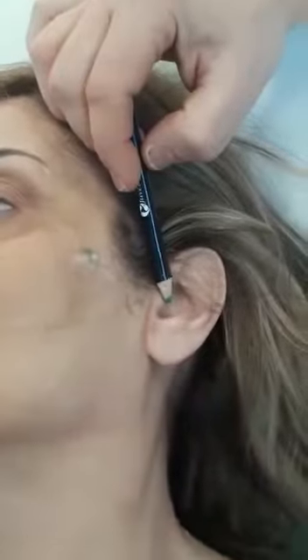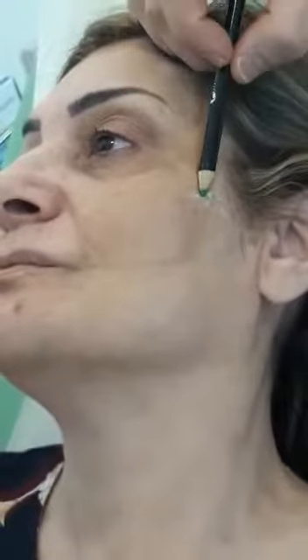Why? Because at this point we have the fascia, the parotid fascia. So the skin is mobile, but the underlying tissue is very firm. And the same here. The skin is mobile, but the underlying tissue is very firm. And so this is a good fixation point.